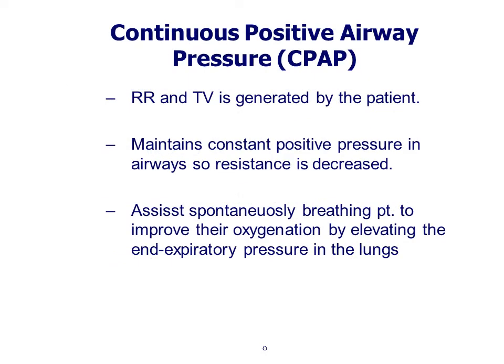Respiratory rate and tidal volume are generated by the patient. Maintain constant positive pressure in the airway so that the resistance is decreased. By providing this positive pressure, the resistance decreased. Assist spontaneously breathing patient to improve their oxygenation by elevating the end expiratory pressure in the lung.